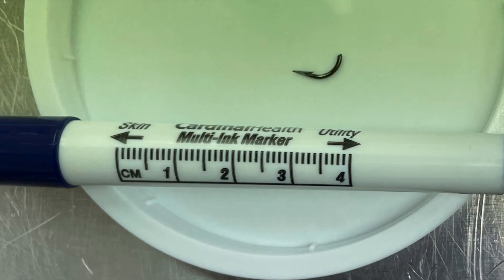Here's the small little hook that was stuck inside the patient, with a little barb. One note to anybody who might be taking a hook out: we do try to take these out antegrade, because it has a little barb on it, and if you end up pulling it out retrograde — or backwards — you end up pulling that barb through a lot of tissue and damaging it.